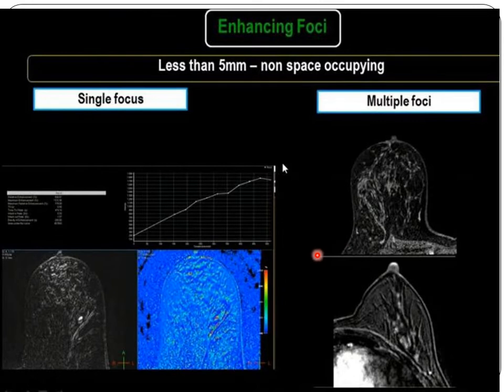If you have a focal enhancement and the other modalities do not give you a clue that this abnormal enhancement may be malignant, the better decision this time is to follow up this focal enhancement in the next 1.5 years to find out if it is increasing in size or not.